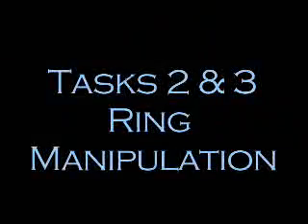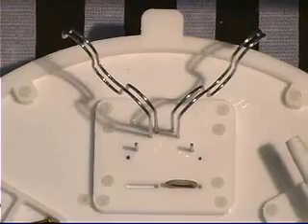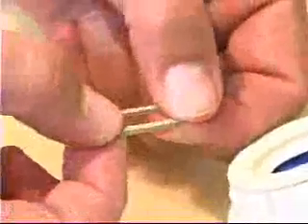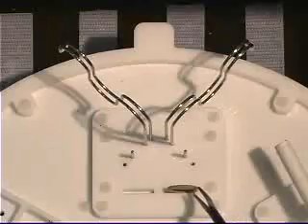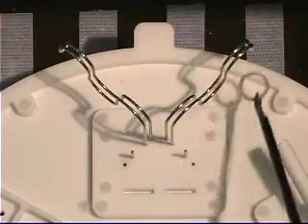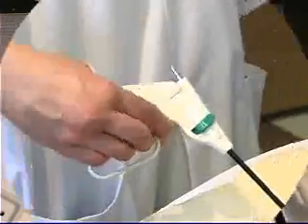Tasks 2 and 3, ring manipulation. This task is performed with a curved forcep and includes a conducting ring. The fragility of the conducting ring is demonstrated here, and extreme caution must be taken, especially when stretching the ring around the pin. The ring is picked up from the pot and guided over the metal post using twisting motions of the wrist. The goal is to have as little contact as possible with the post.